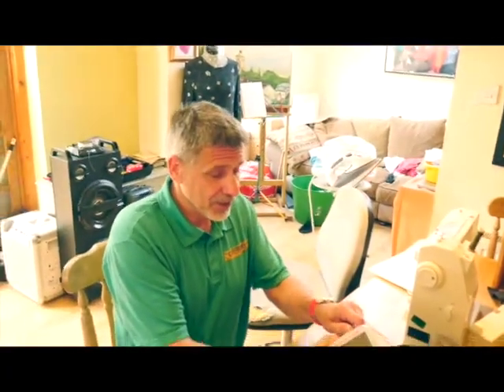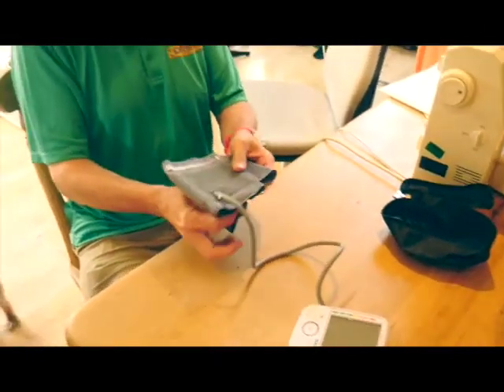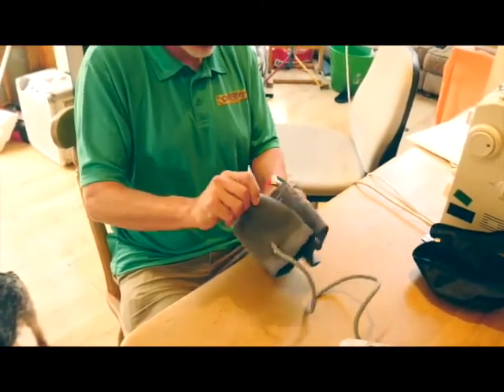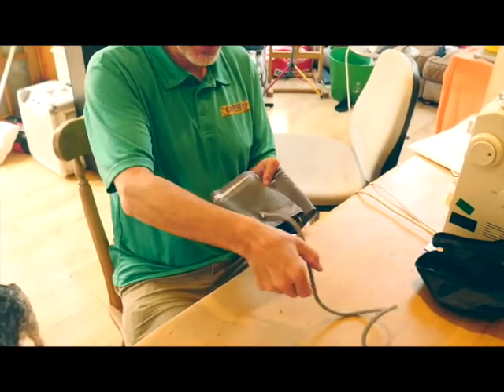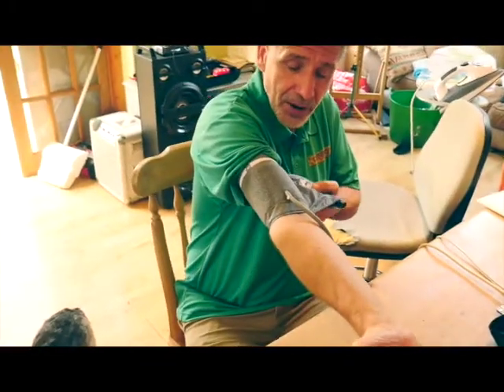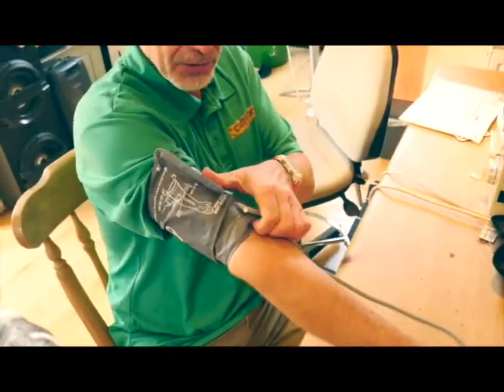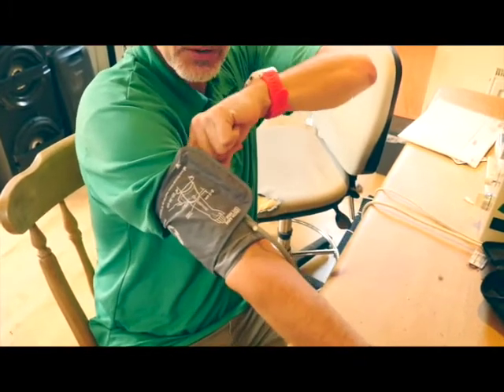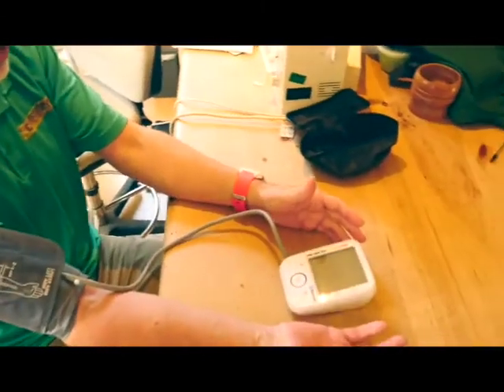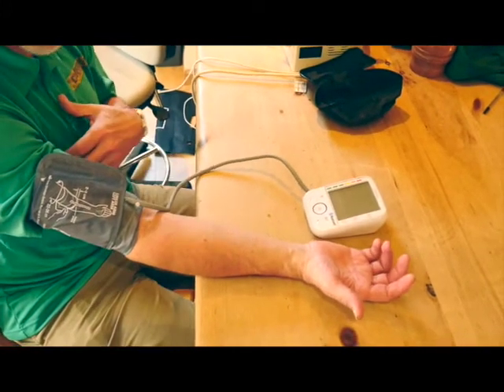Then you've got your gadget and you put it together and you put the cuff on. Let's see if we can show this. With the tube facing away from your head, it needs to be the lower part of the cuff, just above the crease of your elbow. It needs to be moderately tight — you could get a finger in if you had to. Then you have your palm uppermost.